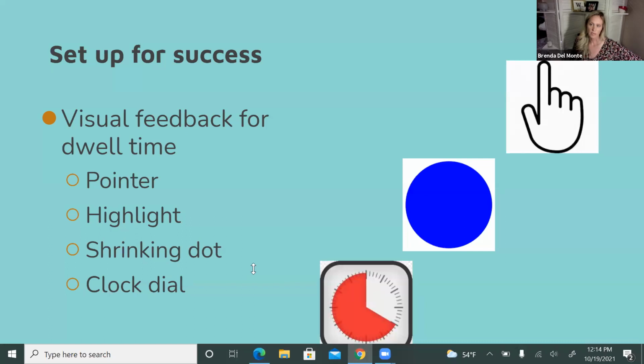You have to order the Accent 1000 or 1400 with Look, which is their camera and software for their eye gaze. But your reps have trials that you can use.